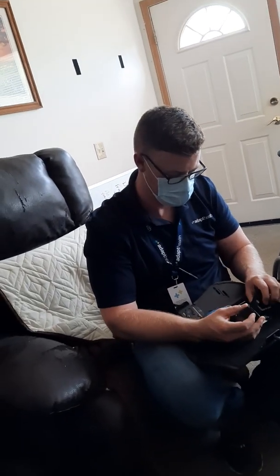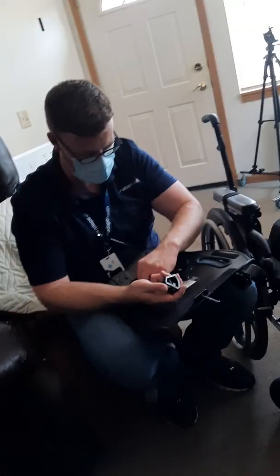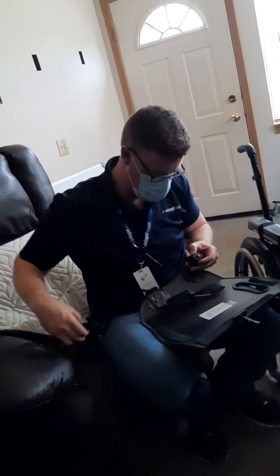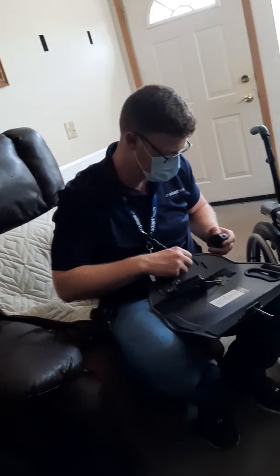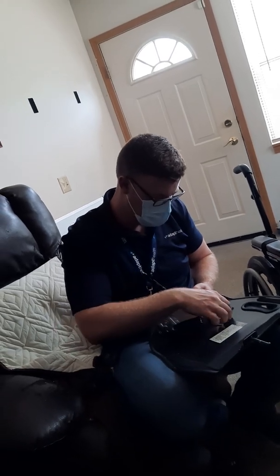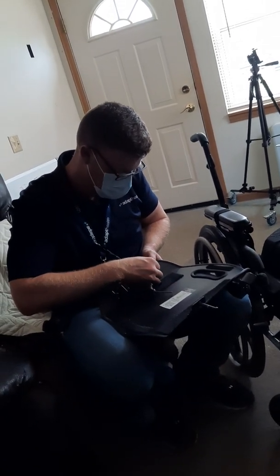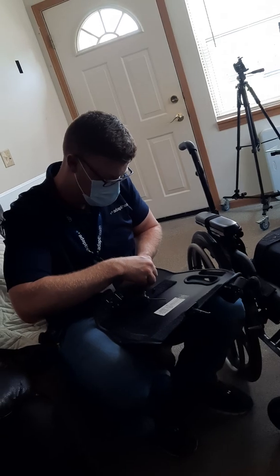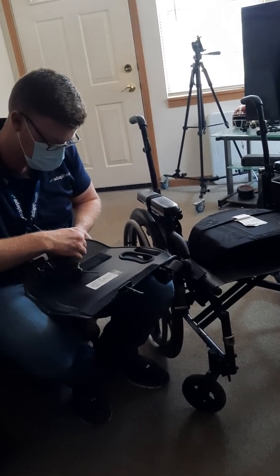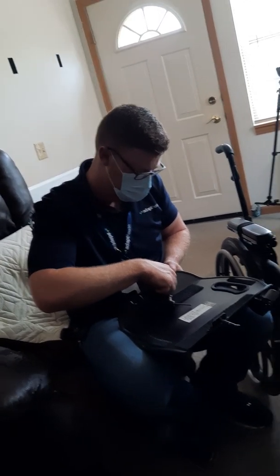So what about on an electric wheelchair? On an electric wheelchair, the number one thing is probably going to be batteries. And how long do those last? Usually they end up lasting between 1 and 2 years. How long are they rated to last for? Are they 2-year rated? Most of the time they're warranted for 1 year. So they're expected to last at least 1 year, and if they don't, there's usually some kind of issue, whether it's the battery or the charger.